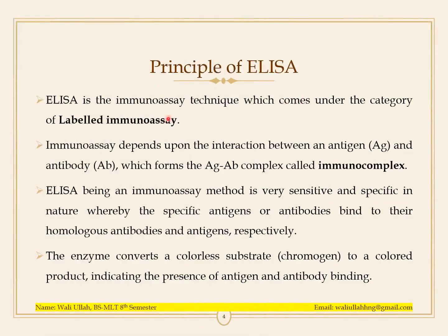Principle of ELISA. ELISA is the immunoassay technique which comes under the category of labeled immunoassay. Immunoassay depends upon the interactions between an antigen and antibody, which forms the antigen-antibody complex called immunocomplex.